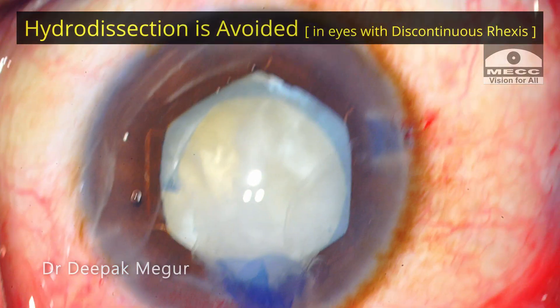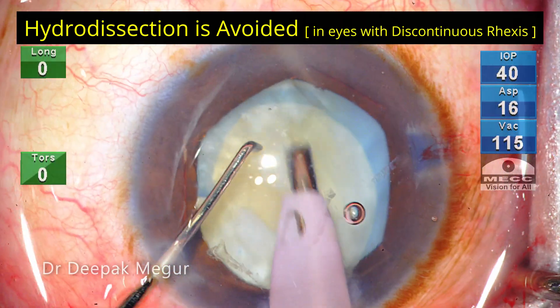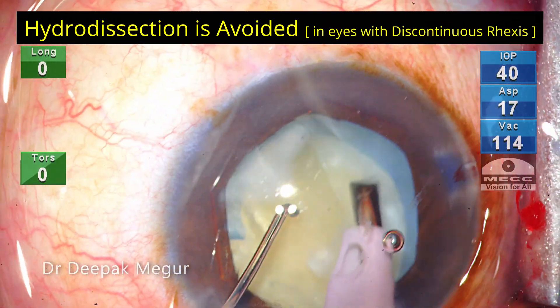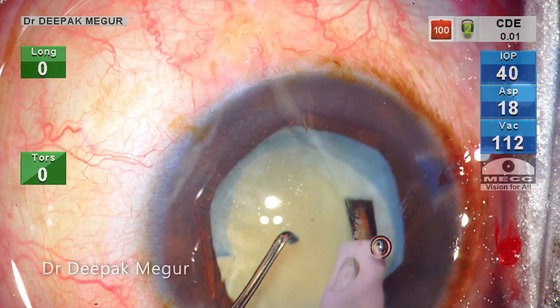Since the nucleus is not bulky and relatively soft, I decided to continue with phacoemulsification. As a rule, in an eye with discontinuous rhexis, hydrodissection is usually avoided — I don't do it now. Time to phaco.